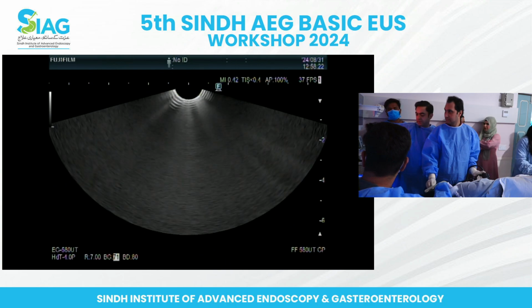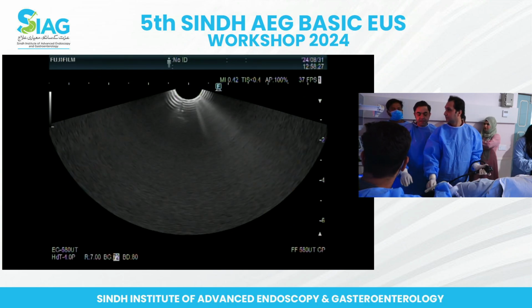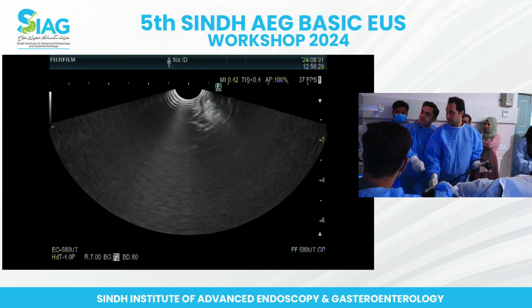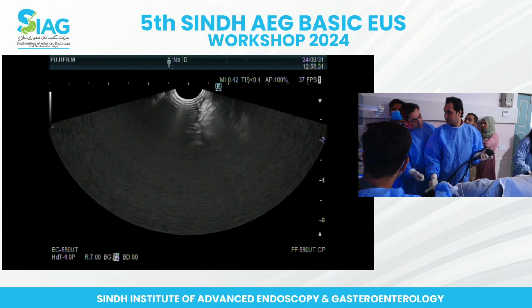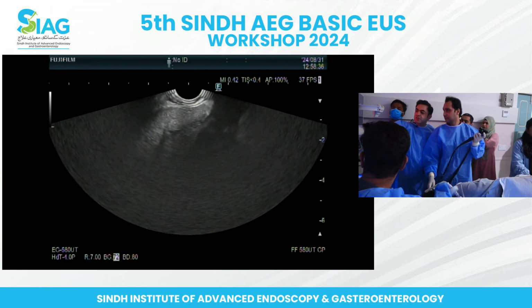Is there a balloon on the scope or no? There is. I think we're on a bit of a hiatus, so we'll just pull back slightly and now just turn the scope around. Let's see your movements. Yeah, keep on here. Excellent, that's good movement. So keep on moving around. You can see the structures are starting to come.